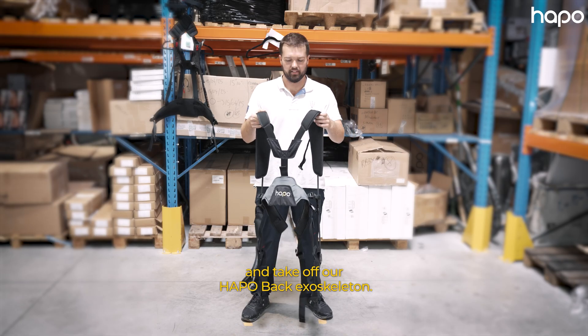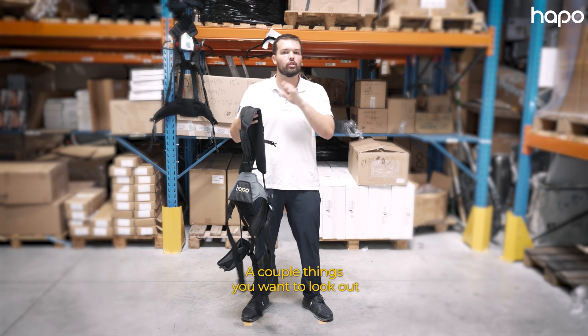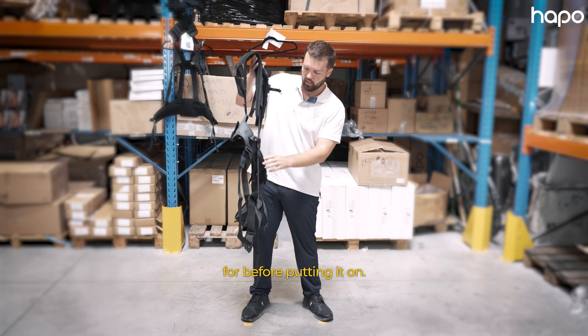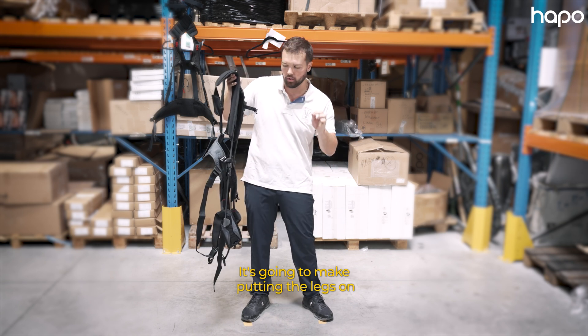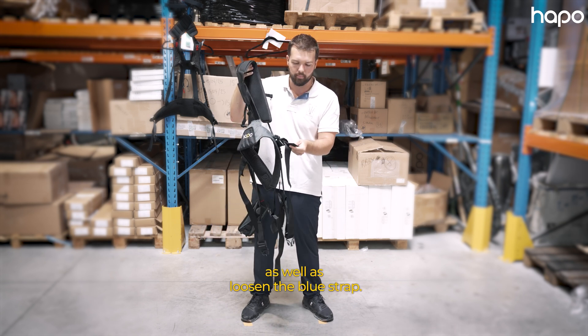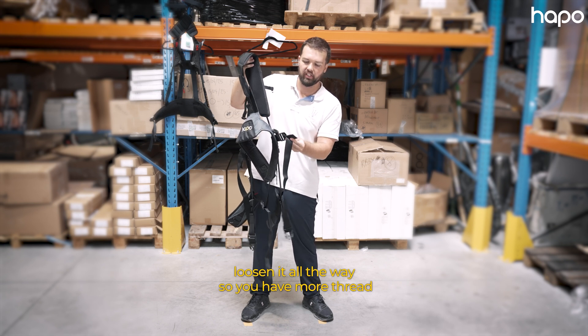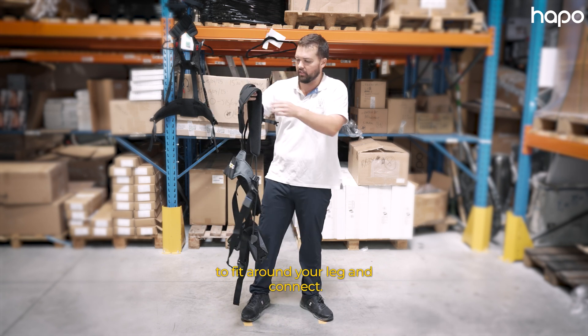I'm going to demonstrate how to put on and take off our HAPO back exoskeleton. A couple of things you want to look out for before putting it on: you want to disengage the springs — it's going to make putting the legs on a lot easier — as well as loosen the blue strap all the way so you have more thread to fit around your leg and connect.